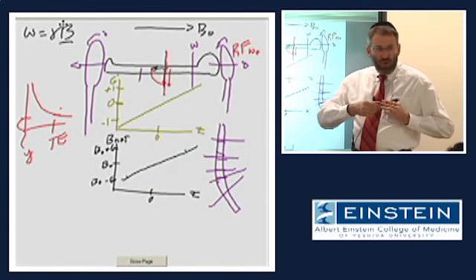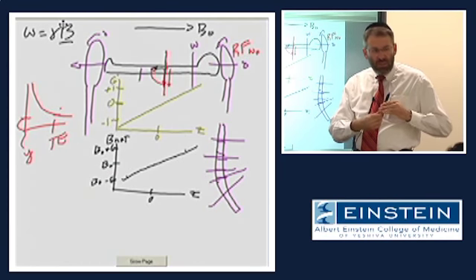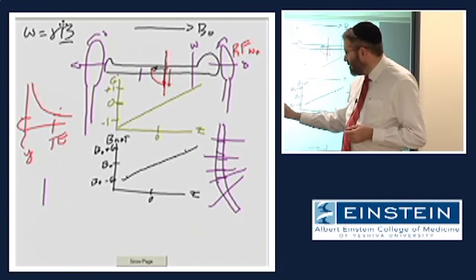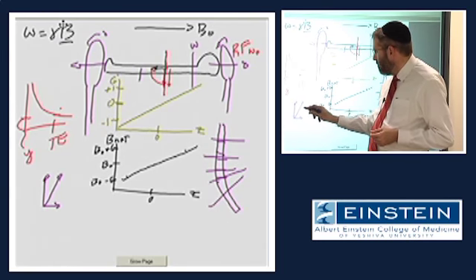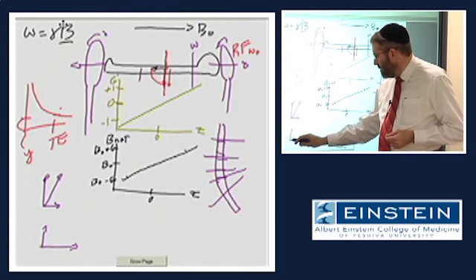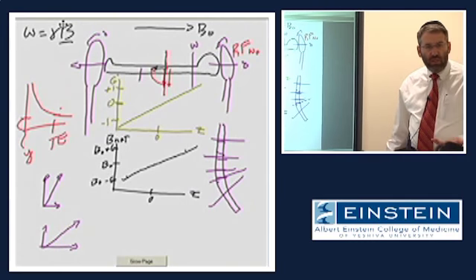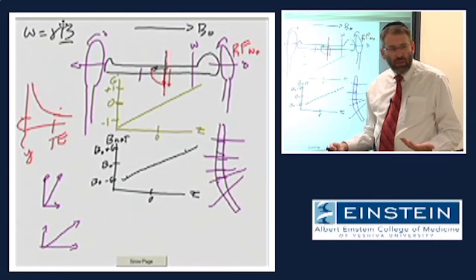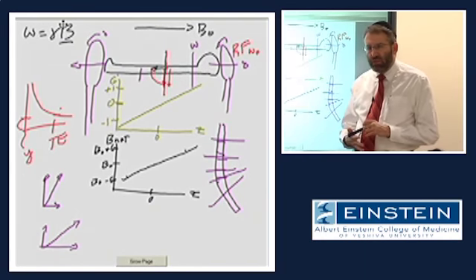And if you want to change the orientation of that oblique, the actual net gradient is simply a vector sum of its components. So anytime you add vectors together, it's the relative magnitude, as Karen said, that gives you the orientation of the net gradient magnetic field. Similarly, you can have any compound oblique simply by using some combination of these three gradient magnetic fields.